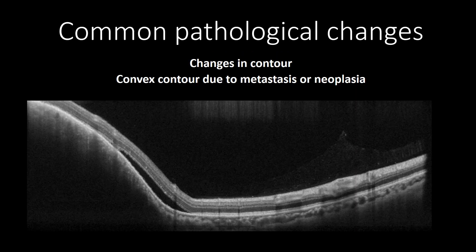Convex contour changes are seen in several pathologies, and the most common is choroidal neoplasms or metastasis. Although myopia can show dome-shaped changes, it is rare. In OCT cross-sections presenting with convex changes in contour, choroidal neoplasm should be suspected, and further investigation should be carried out to rule out a tumor.